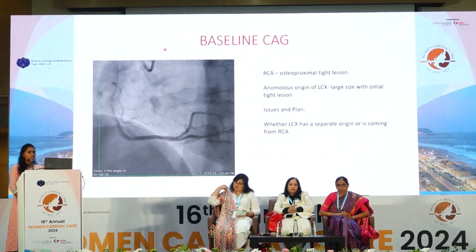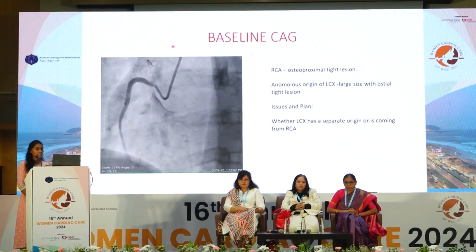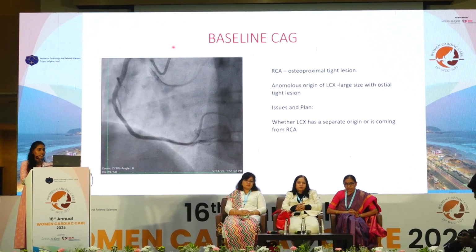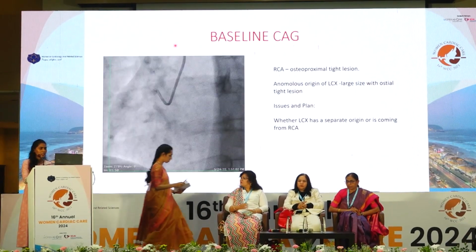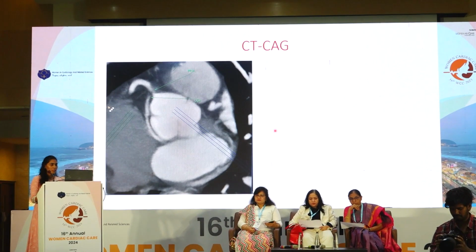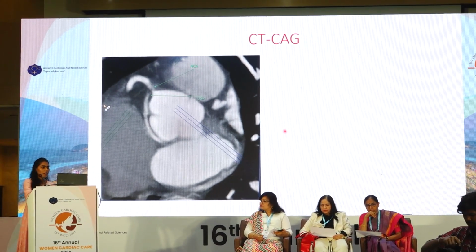Here, an angiogram was done elsewhere, which showed anomalous origin of a large-size LCX coming from the RCA ostium and also showed RCA. So we had to answer a couple of questions here, however, we decided to do a CT-CAG because it gives information beforehand and helps us make a plan about our strategy.